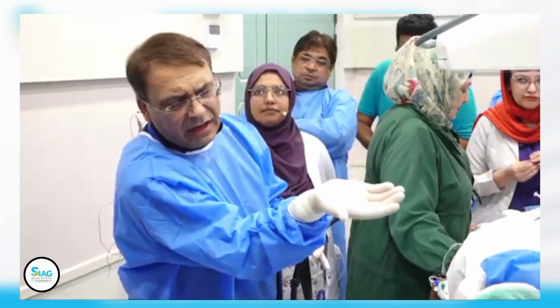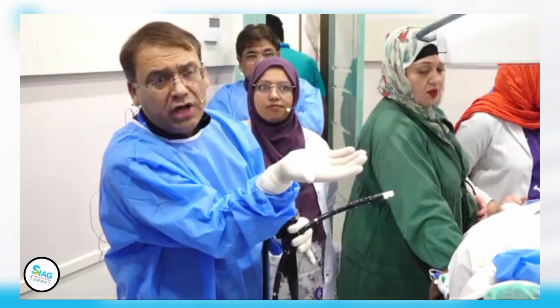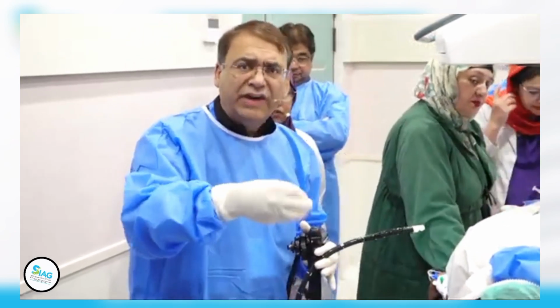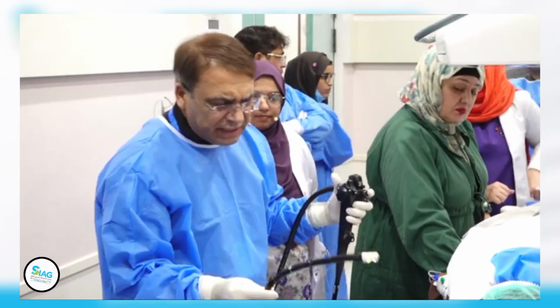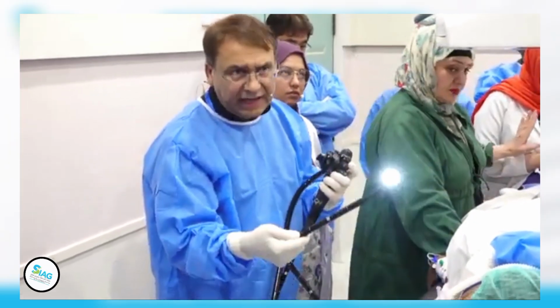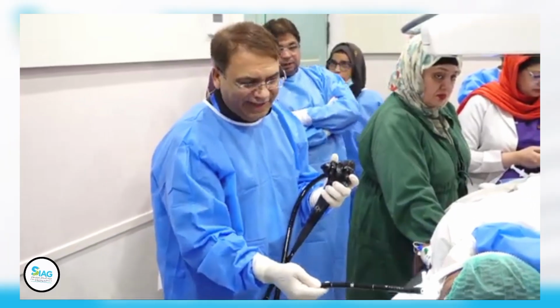It hits the back part of the hard palate. As soon as I hit the back of the throat, I flip the scope. That takes me straight to the oropharyngeal area right above the upper esophageal sphincter. So that helps me basically pass the scope even in a difficult situation. So you see how I made that U-turn? They need to patent this.